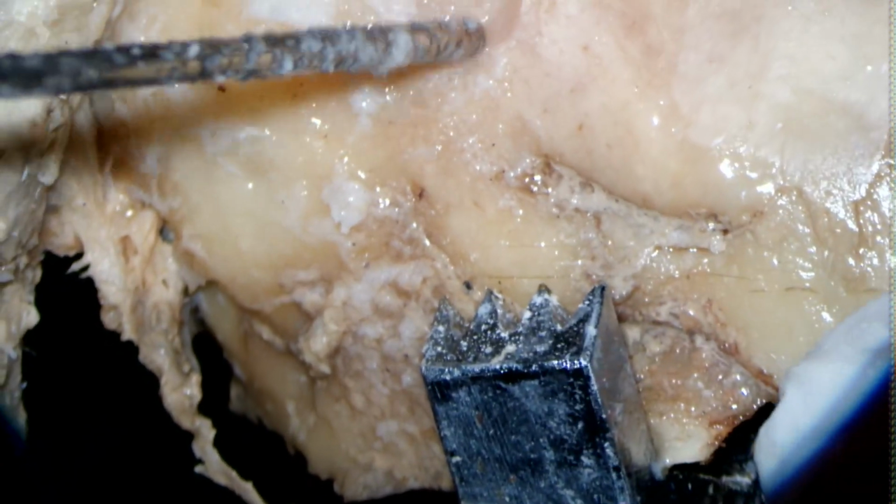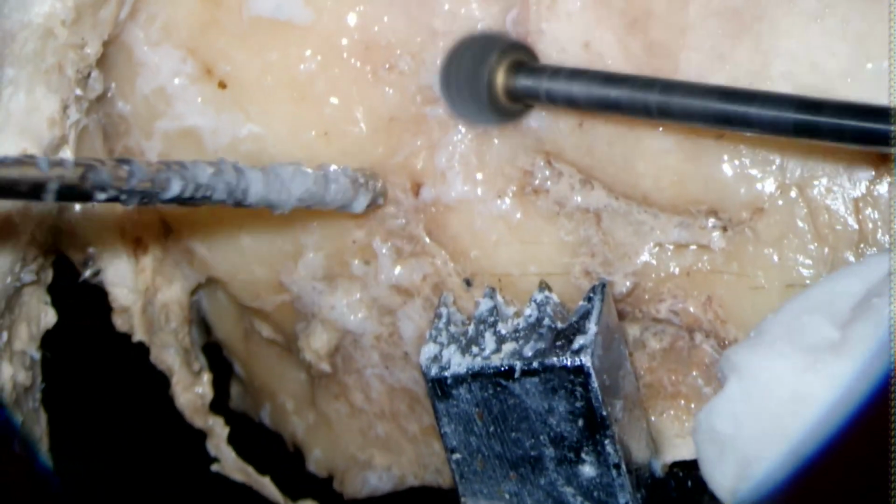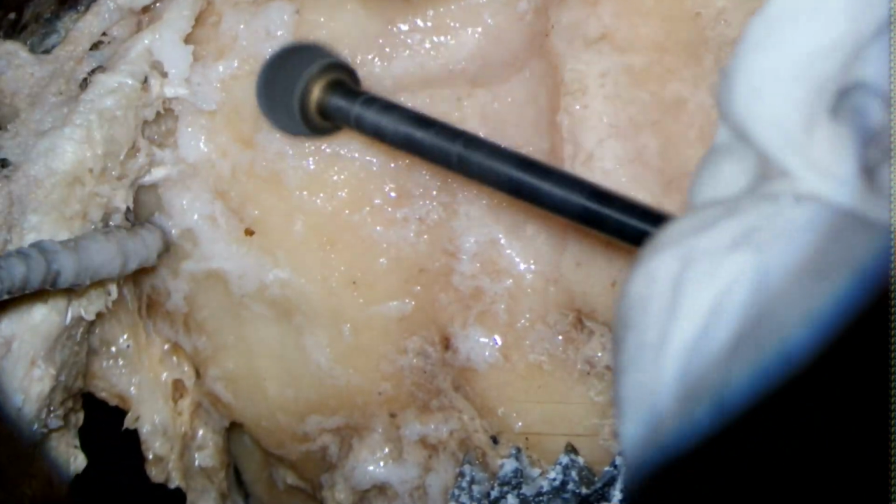Okay, so can you see this here? So this is the superior limit. Here is the posterior limit. And this is the triangle we are actually.